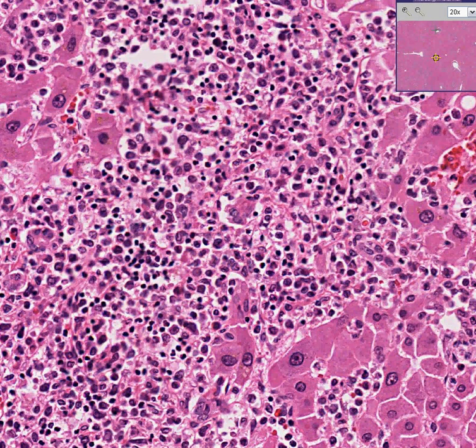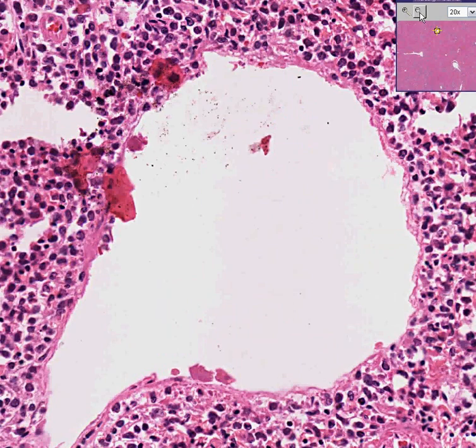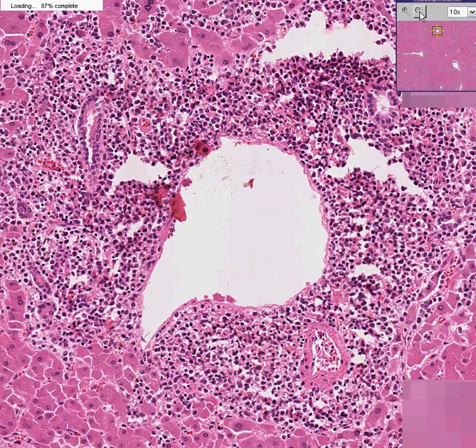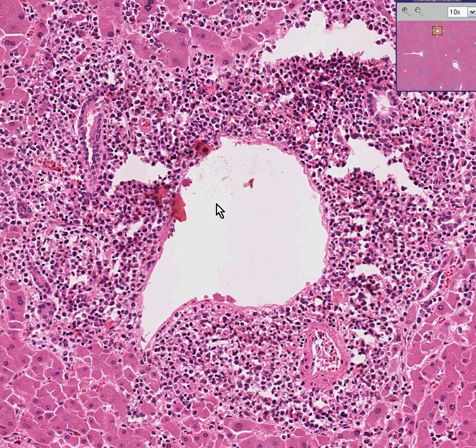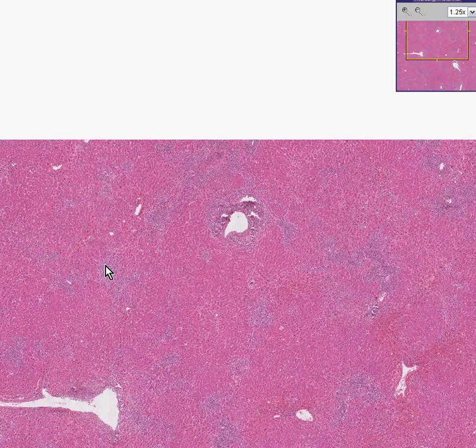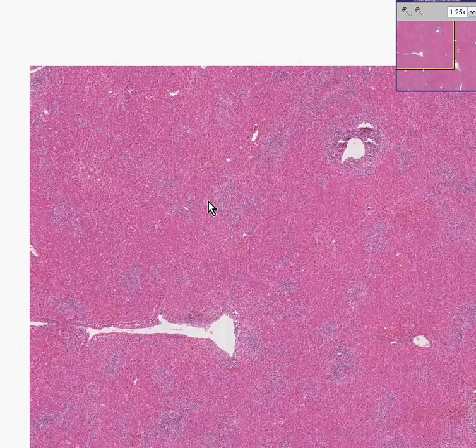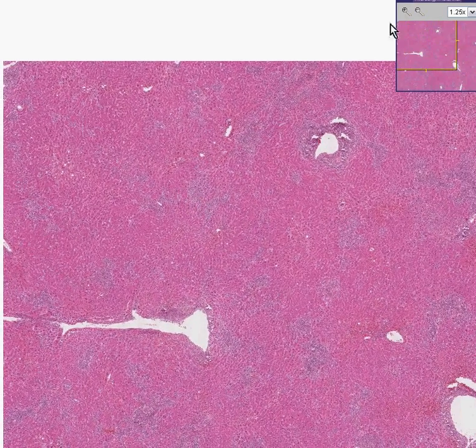If you go to a portal area you'll see some blast cells around there as well, but if you step back and look at the big picture — here's a portal area, here's a central vein, portal bile duct, and hepatic artery — it's also largely blast in here. Most of the infiltrates in this liver are not in portal areas. This is a case of acute myeloid leukemia involving the liver.